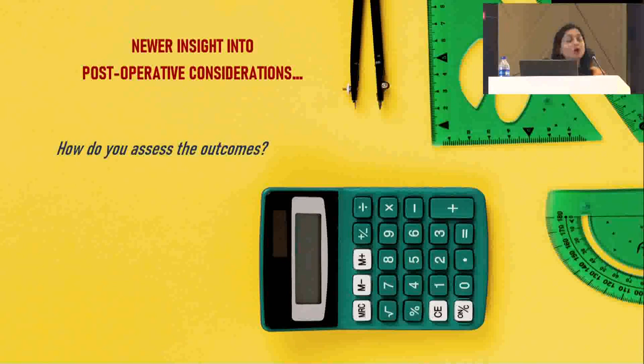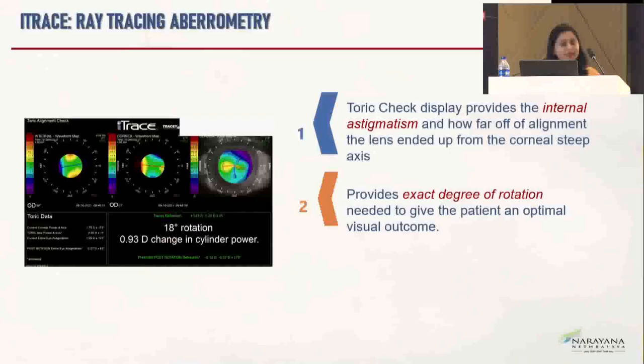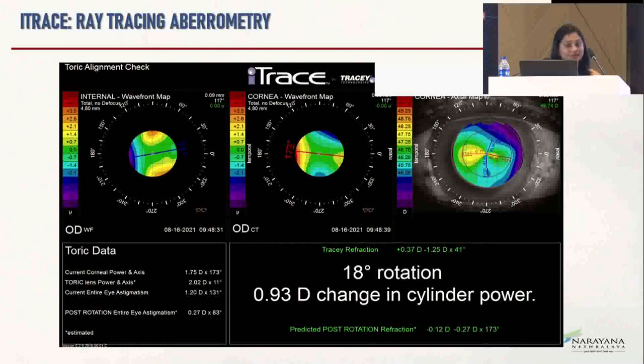So what do we do post-surgically? How do we assess if the patient has residual astigmatism or if there is any misalignment in the axis that I have placed? For this, multiple evaluations can be done. We have our iTrace. iTrace is a machine which displays the internal astigmatism, and it will also tell you how far off the alignment we are, and it will tell the exact degree of rotation. So what is the lens placement and what is the rotation that has happened post-surgery? If you need to realign, it will tell you how much it is rotated by.